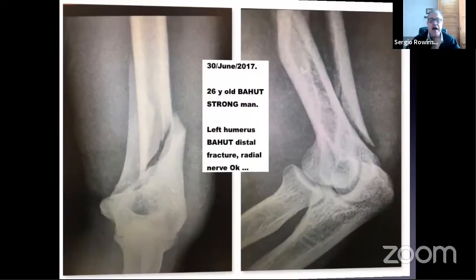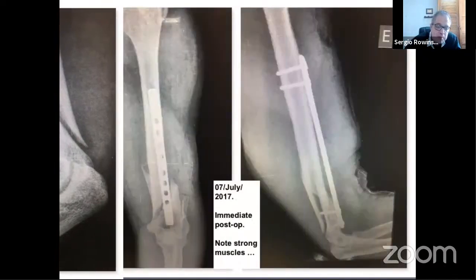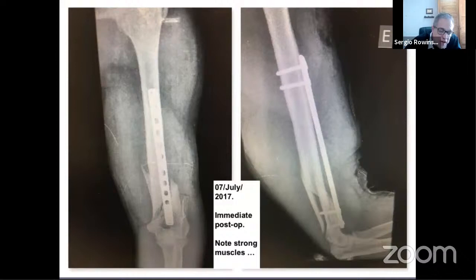Well, the thing is, I can go extremely far as long as I can put 2 screws anterior. No place for mistakes. Extremely strong man. He goes to the gym. So everybody would say, well, you cannot put an anterior bridge plate. I can, no place for mistakes. And everybody would look at this construction and say, this is going to fail. I have a very personal way of conducting these cases.